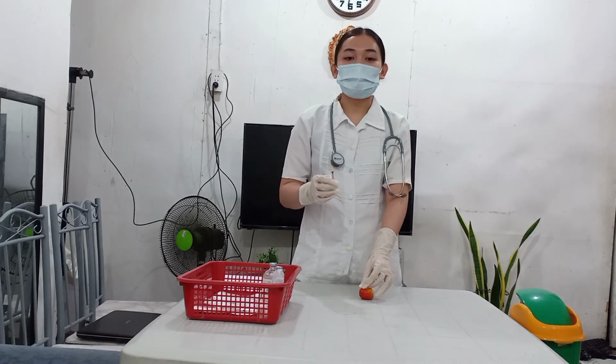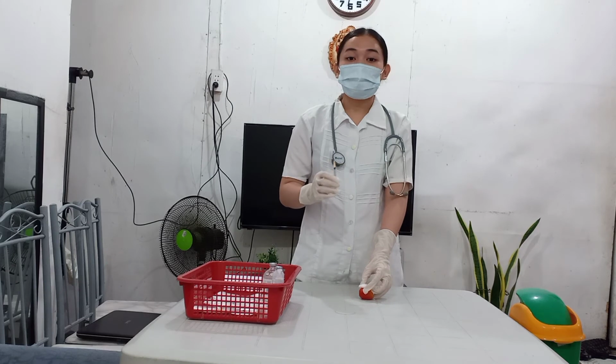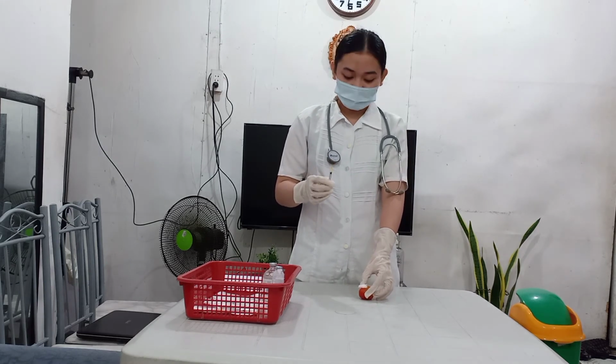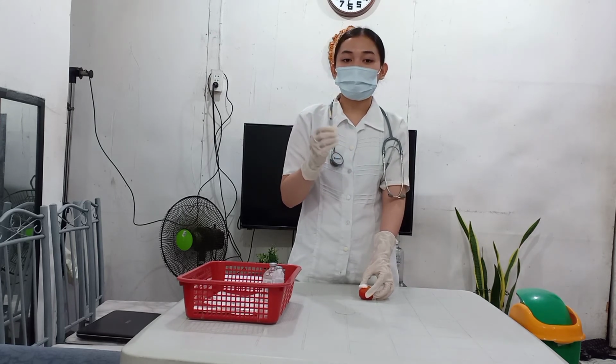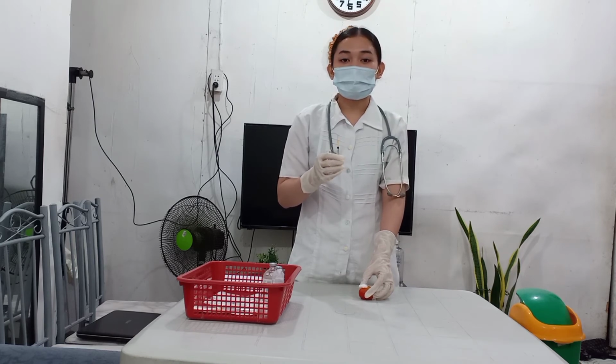Now, we assist the client to a comfortable position. This is to provide the patient's comfort. And then, we discard the uncapped needle and syringe in a disposable needle container because most accidental needle sticks occur while recapping needles. Proper disposal prevents injury.